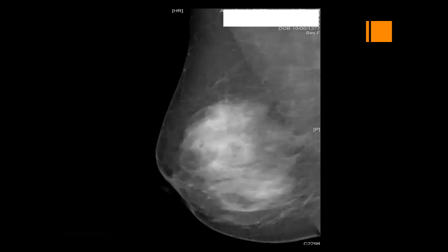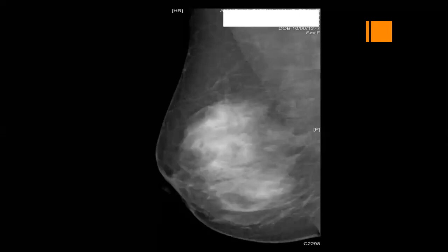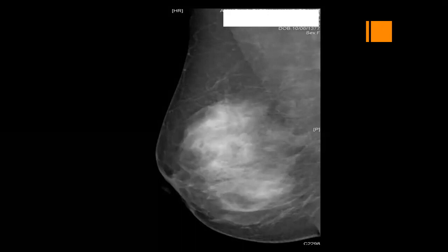Can you see any abnormality in this mammogram, or do you pass it as normal? The rounded area. If I tell you she's an asymptomatic lady, will you pass it? Rounded area in the middle zone. Middle zone? Here? No, anterior. Here? Upper? Above? More above? Yeah.